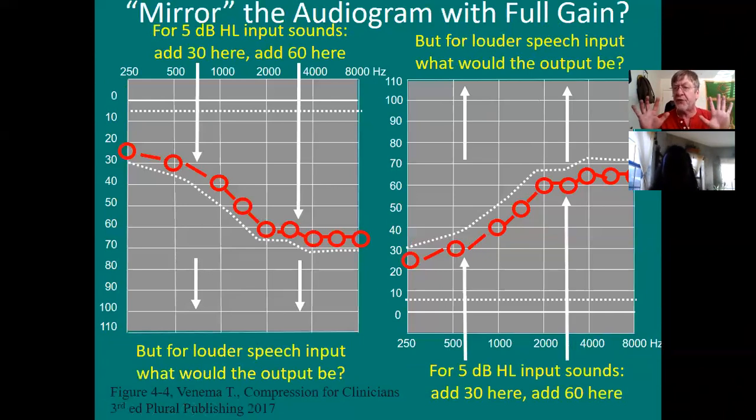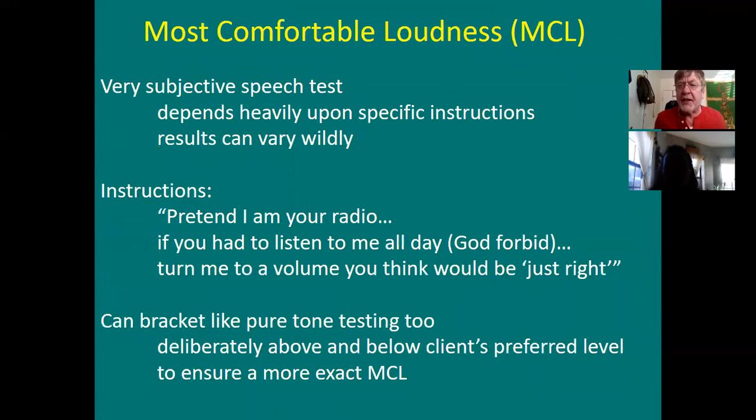I have to back off, Jack. Well, let's look at MCL. I always give my clients instructions like this. Pretend I'm your radio. If you had to listen to me all day, God forbid, turn me to a volume you think that would be just right.